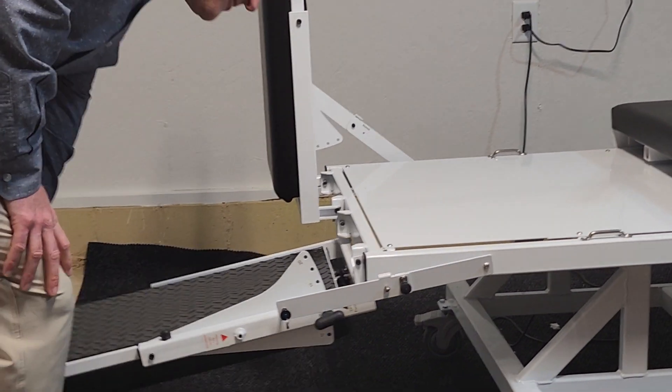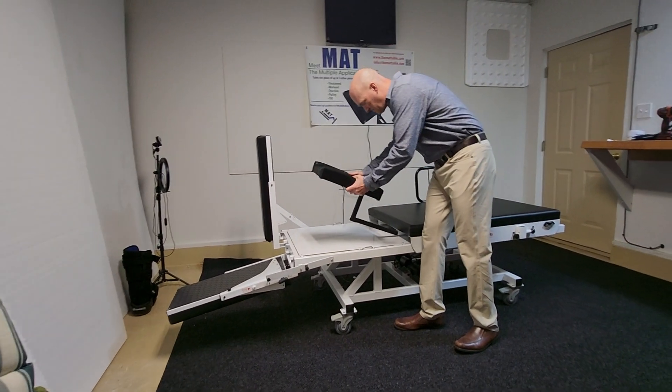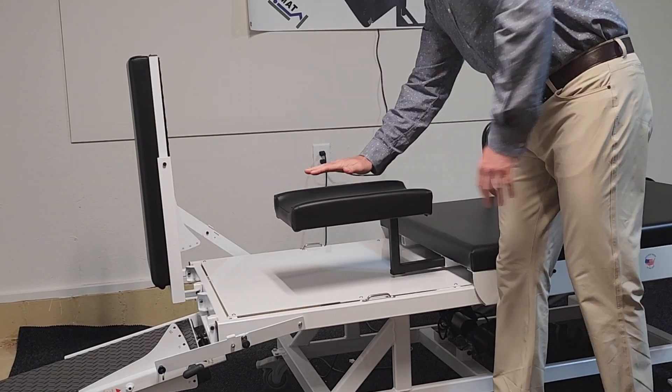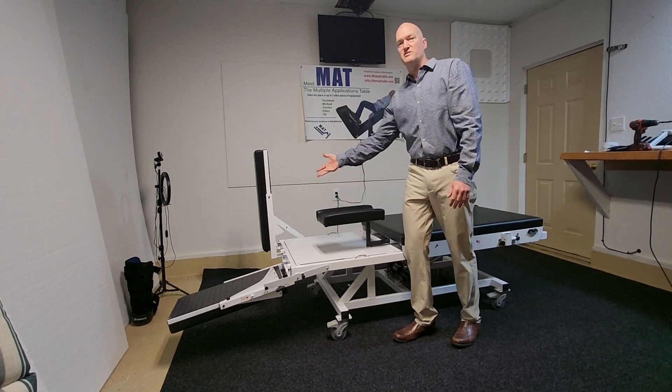Then lower this down — and that's okay if it touches the floor. This gets placed here, and the person doing the squats can put their casted leg, or the leg they are not wishing to use, here, and then you'd commence squats.